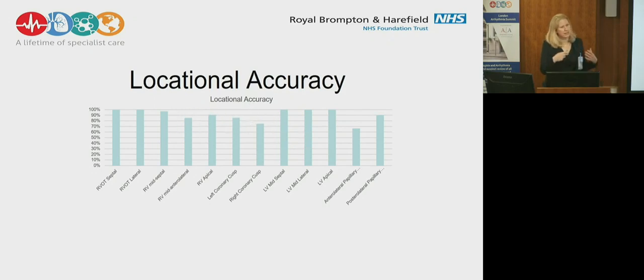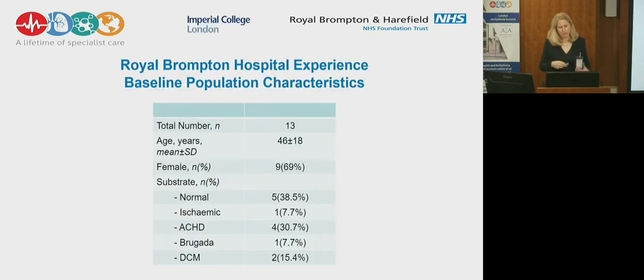And it gives a little bit of a preparation maybe to say, okay, this is possibly where we need to look in better reconstructions. I should also say that at the moment, the reconstruction of the cusp area itself, as it is an extracardiac structure, is not really that well supported by the software. And by pushing that a bit higher up, I think we're going to get better at this.